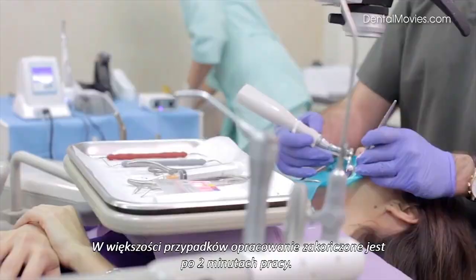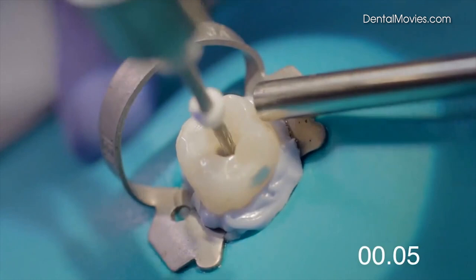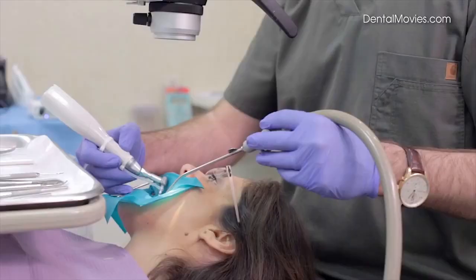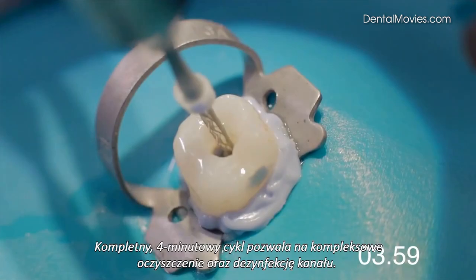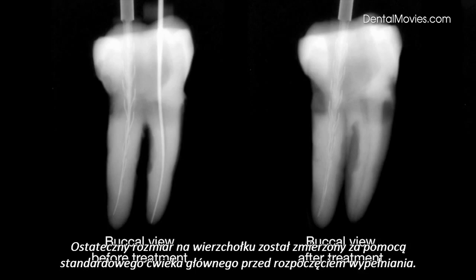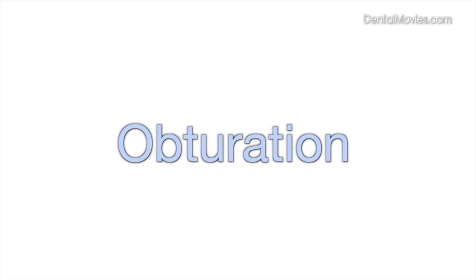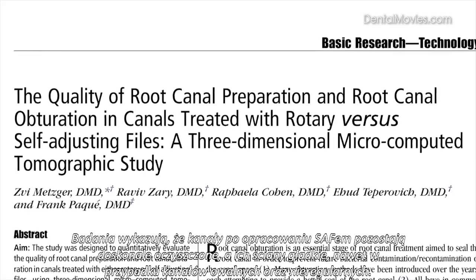Most of the canal shaping is accomplished during the first two minutes of operation. Completing the full four-minute cycle allows the irrigant to thoroughly clean and disinfect the canal. Final apical dimension was gauged using a standardized gutta-percha master cone prior to obturation. With the SAF, the final canal shape remains consistent with its original anatomy. Research shows that the SAF mode of operation results in an exceptionally clean and smooth root canal wall surface, even in oval and irregular shaped canals.